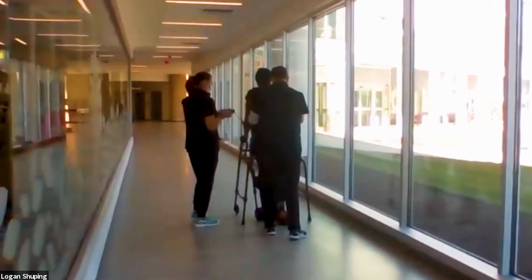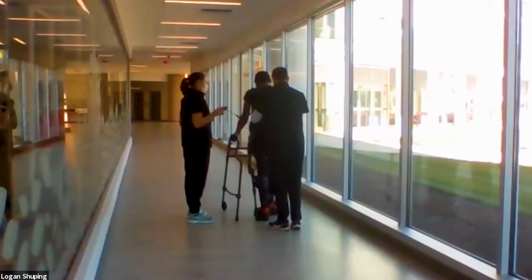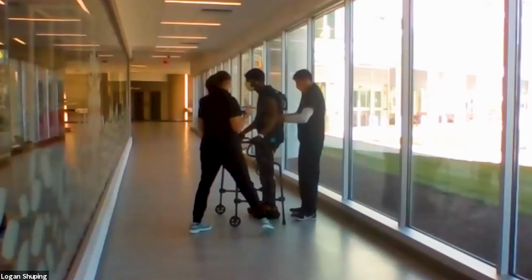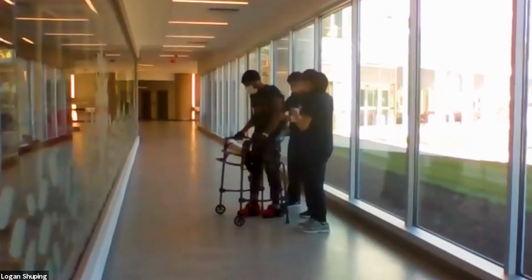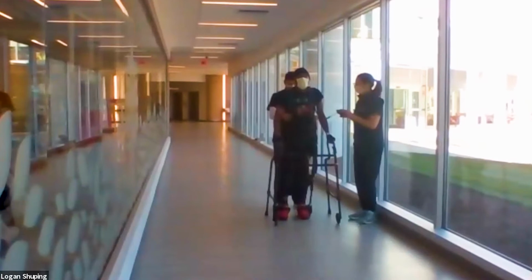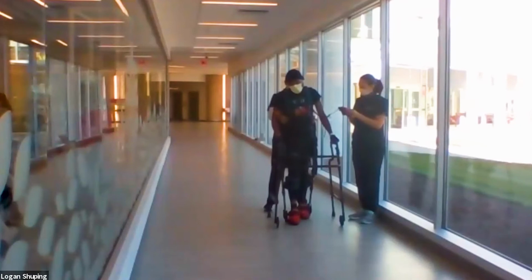So you might be able to hear the beeps as they went by. The beeps are an indication that he is shifting his weight far enough to be able to take a step. So a bit of auditory feedback for patients. They're going to do a U-turn here. So they completed their turn. They're going to get back into walking mode.